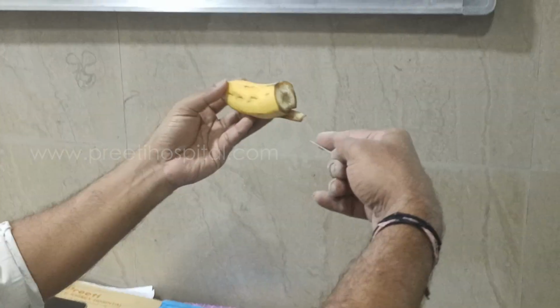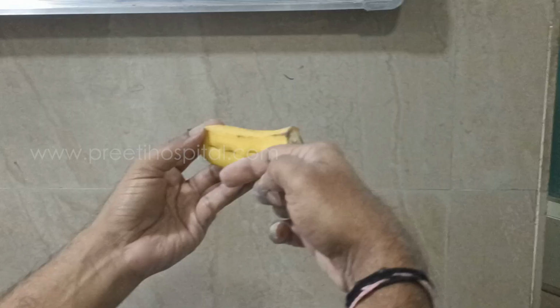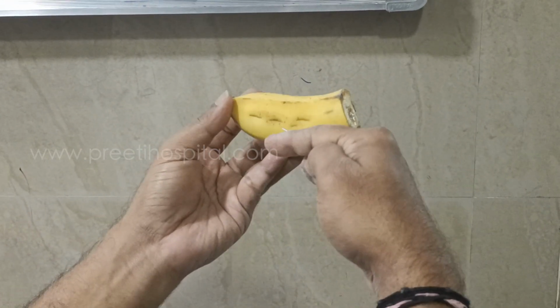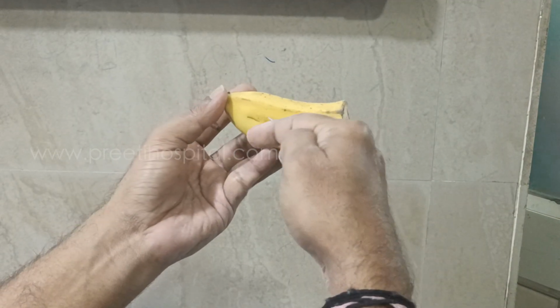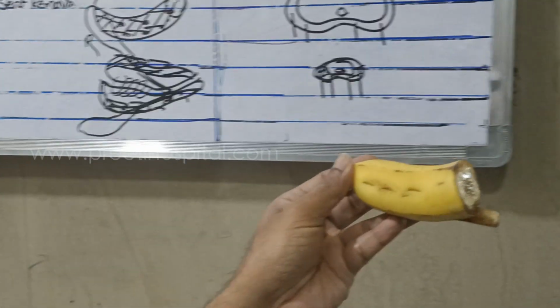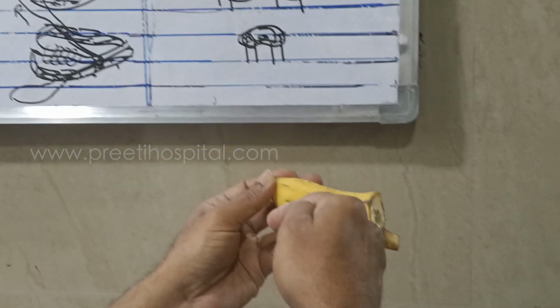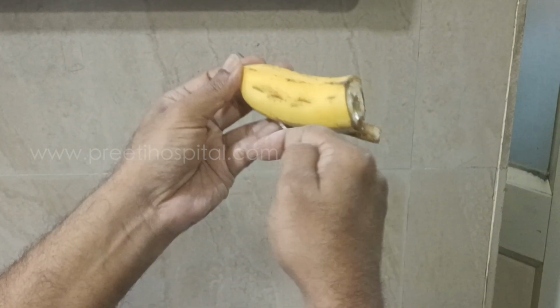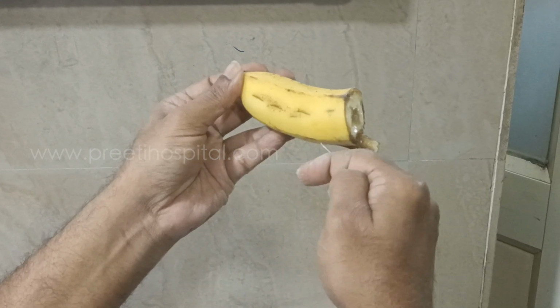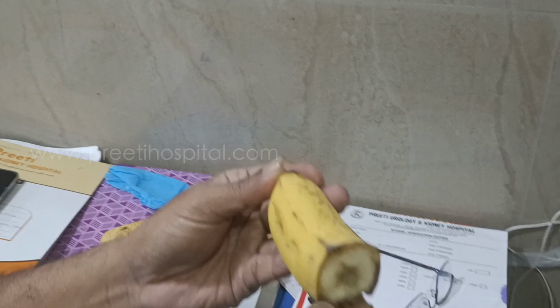So what we are doing now is side firing. It is coming from the side like this, crossing. The probe is like this, but it is coming like this. So anteriorly there is no tissue. First is this surface I have shown. Only one side you are seeing. One side if you see, lateral 1, lateral 2, lateral 3. Posterior lateral, posterior 1, posterior 2, posterior 3. You got the point.